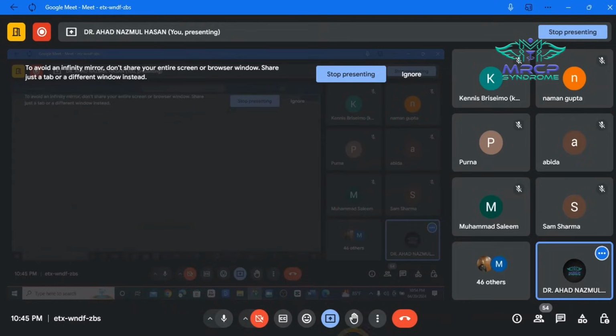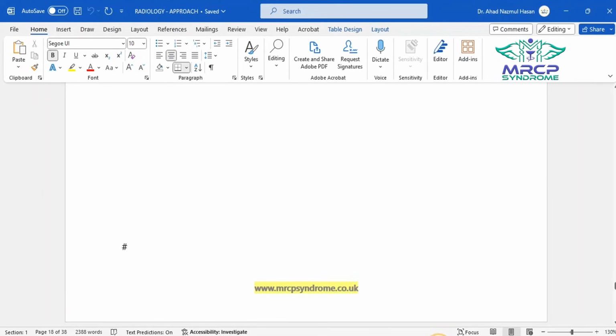So is it clear for everyone? The T1, T2, the overall overview, the colors. Is it clear for everyone? Yes, sir. Okay, to an extent it's clear. Okay.